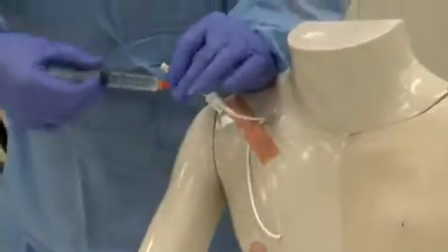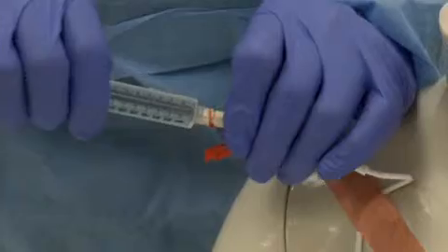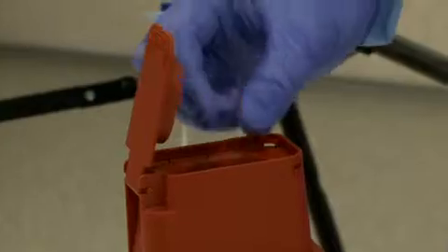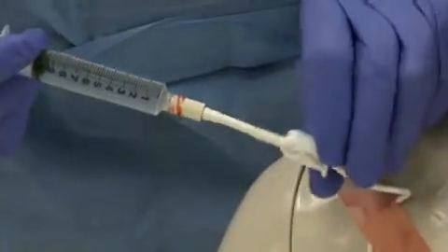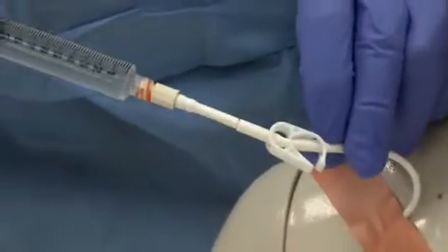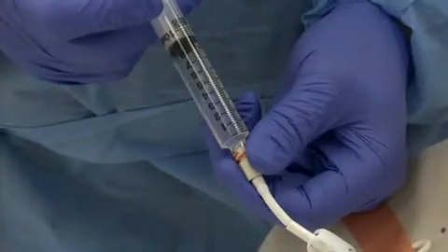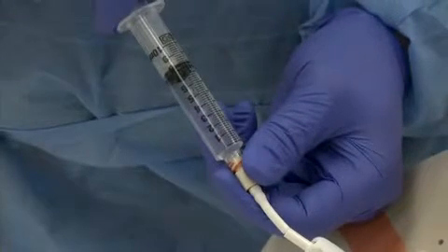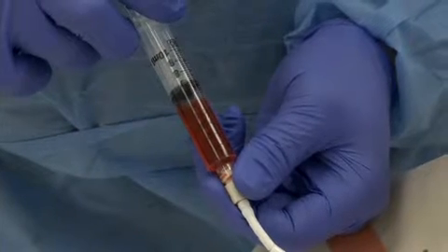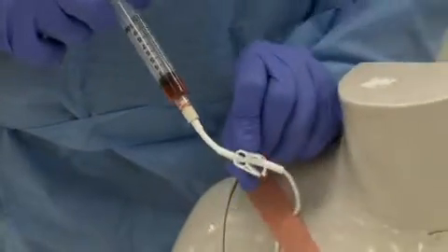Next, attach the saline-filled syringe after removing and discarding the blunt access needle. Secure the syringe to the Luer lock and again release the clamp, allowing the saline flush to now be infused to assess patency. First inject 2 cc's of saline and then withdraw 2 cc's of blood. Complete the process by injecting up to 8 cc's of saline. This process confirms that the line is patent and accessible for fluid and drug administration.